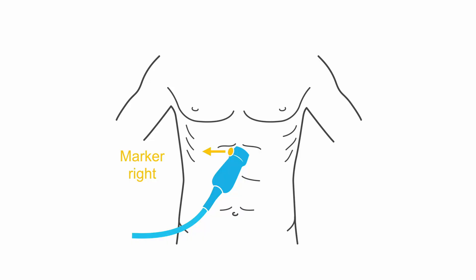The next view we're going to review is the sub-xiphoid view. Here, you're going to bring your phased array probe underneath your patient's xiphoid process, with the indicator to your patient's right. Tuck the probe underneath the xiphoid process — it will actually help to place your index finger on top of the probe and, using your palm, flatten out the probe and push it up towards the xiphoid process, looking into the chest cavity.